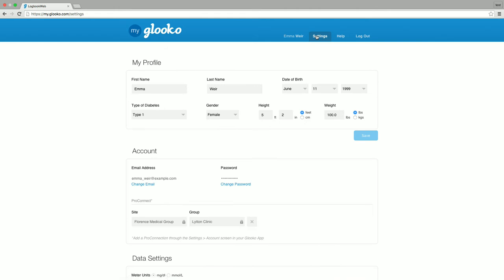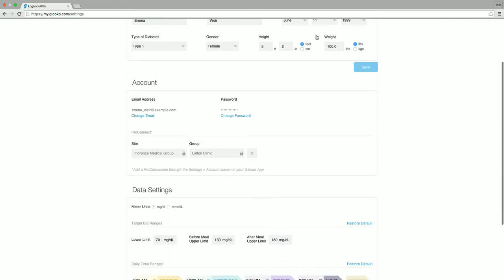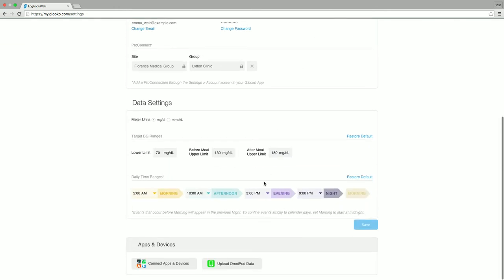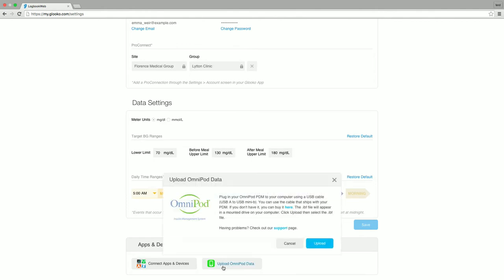Scroll down until you see the apps and devices section. Click upload Omnipod data to begin the web uploader.